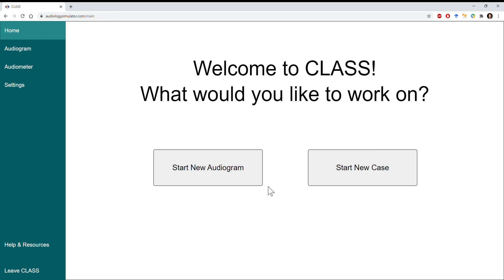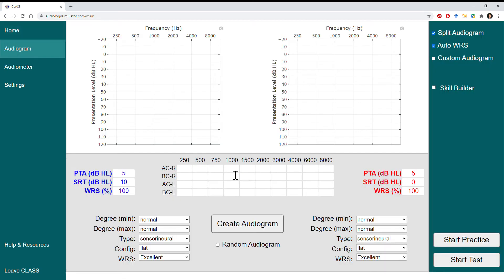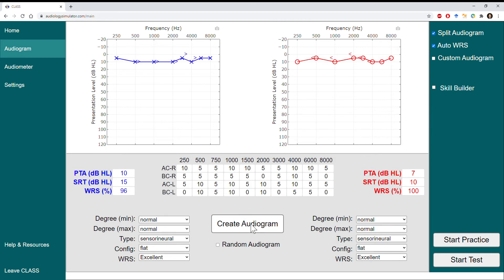Let's find all the thresholds for our first hearing loss profile. We'll click 'Start a New Audiogram' to be taken to the hearing loss profile designer. Let's keep things simple by keeping the default settings to create a normal hearing loss profile with normal thresholds for air and bone conduction in the left and right ears.